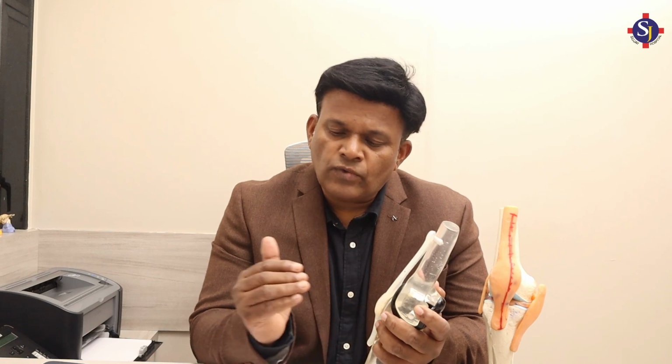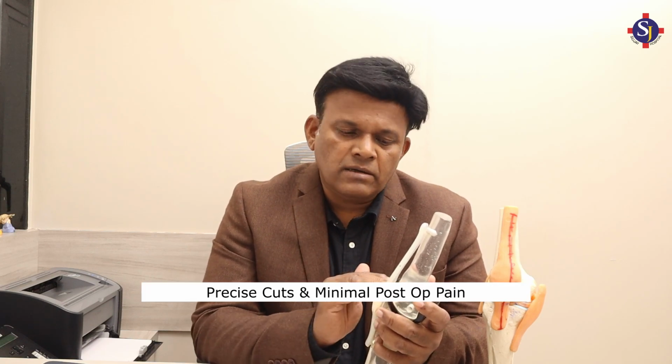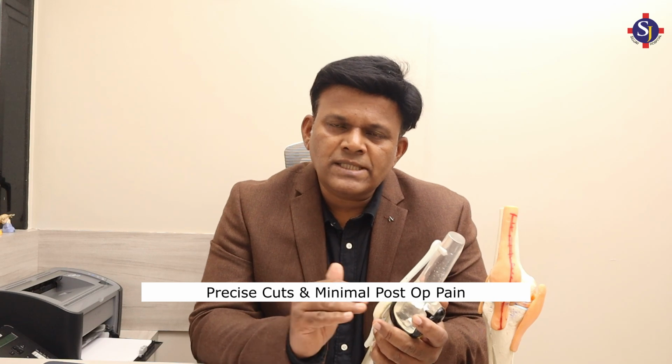Now, we were already doing MIS, that is a small incision knee replacement surgery, and we were always using the high flex imported implants. So what has changed is that robotics has improved the cuts. The cuts are really precise and very minimal, and hence the post-op pain is much less. The robotic is basically to take the good cuts, optimum cuts, precise cuts, so that you get the best knee replacement surgery outcome.